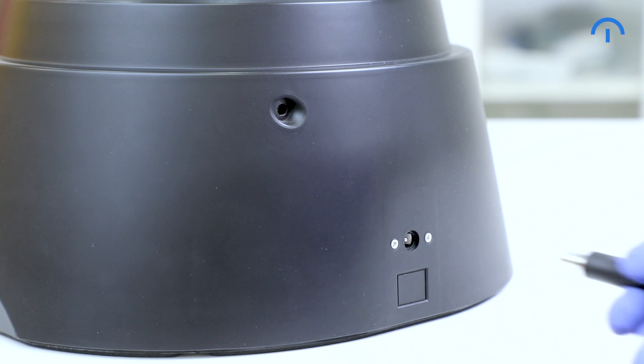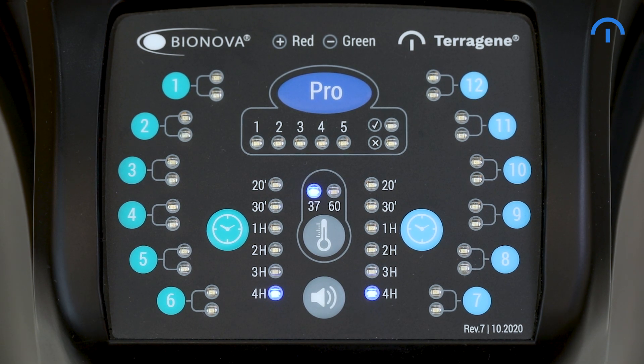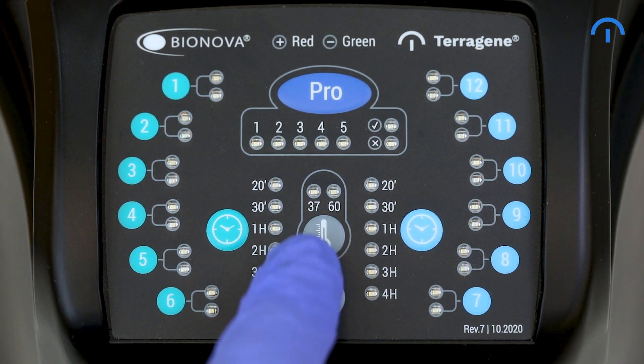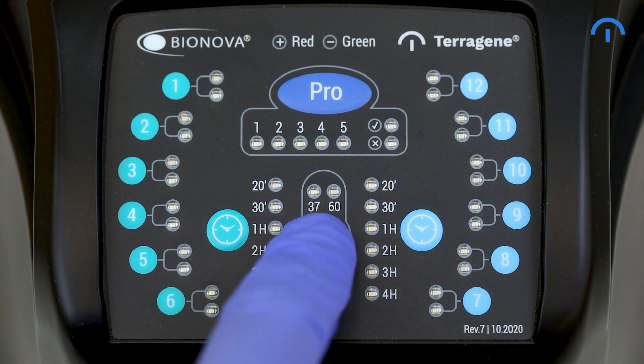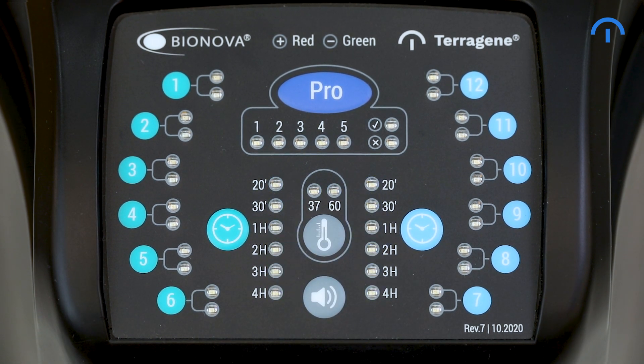Turn on your IC1020FR by connecting it to a power source. The last incubation program will be selected by default. For biological indicators readout, hold the thermometer button to set the temperature. Use the same button to choose the right temperature for the corresponding readout program and wait for the autoreader to reach it.